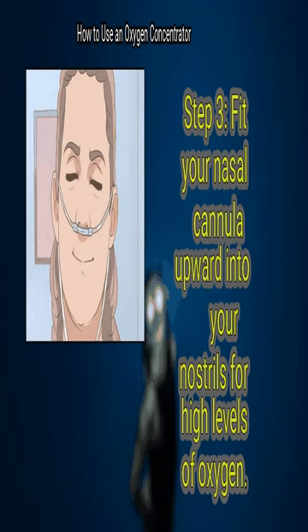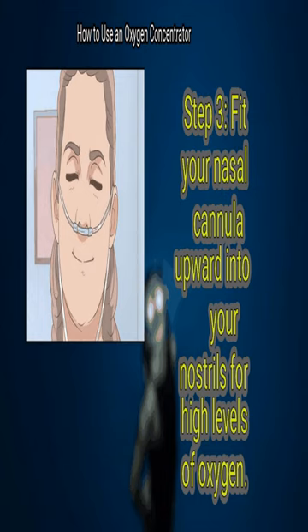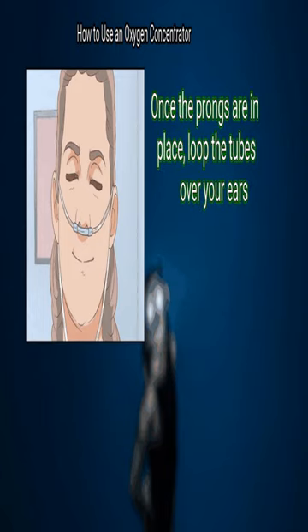Step 3: Fit your nasal cannula upward into your nostrils for high levels of oxygen. Each prong of the cannula should curve up into one nostril. Once the prongs are in place, loop the tubes over your ears.